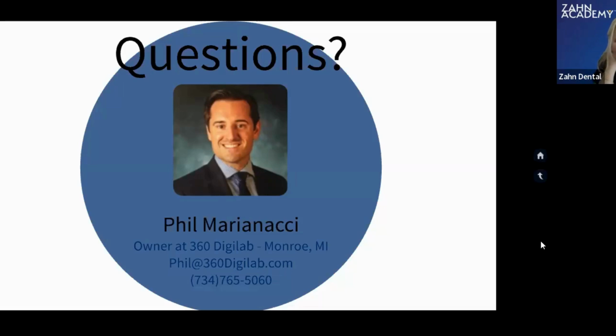Right now I have one. The first one is they want to know if there's any formal training, because the software is pretty amazing and it's pretty robust. Do you know anything about that, Phil? Yeah. With Nemotec, it is mandatory that you get training, and there are a lot of different ways depending on what type of functions you're looking to do. If it's surgical guides, or smile design, or maybe you want to stage it. But absolutely, I'd reach out to Zahn, and I know that over at Nemotec, Lucia and their group are going to train you on all these things that you're going to need.